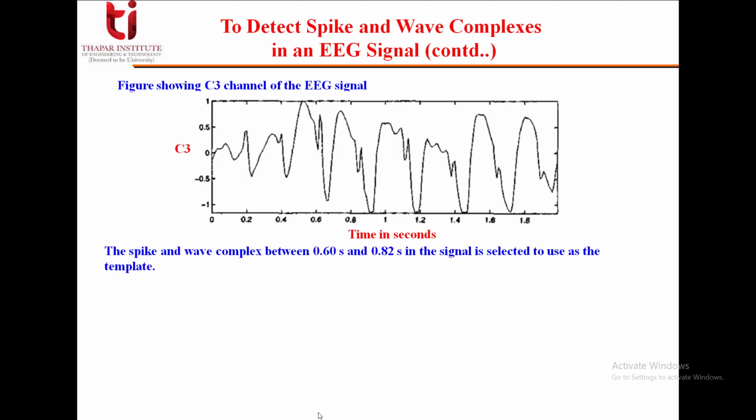The spike and wave complex, you can see, is between 0.60 second and 0.82 second. We are selecting this range to use as a template.